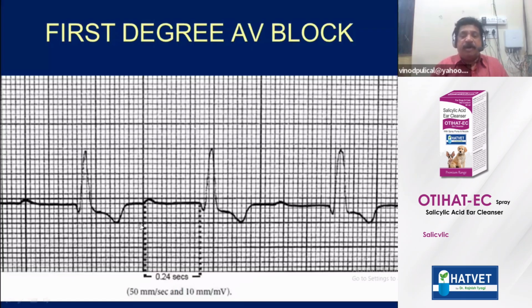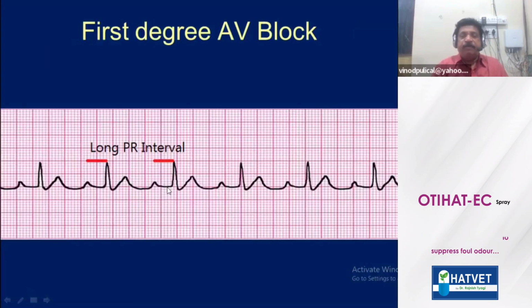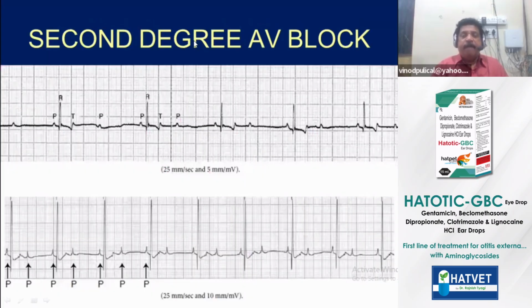Here is the first degree AV block. You can see the increased PR interval. Here it is 0.24 seconds. Yes, a long PR interval, that is first degree AV block.